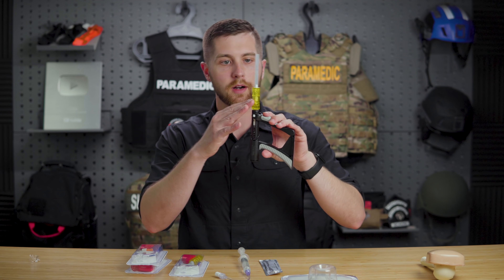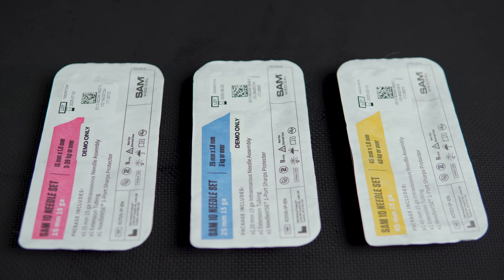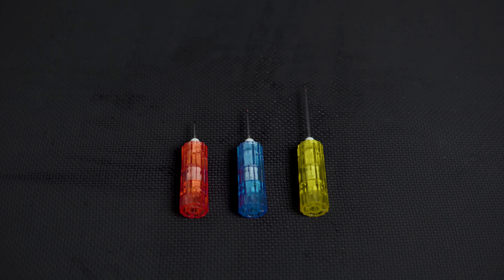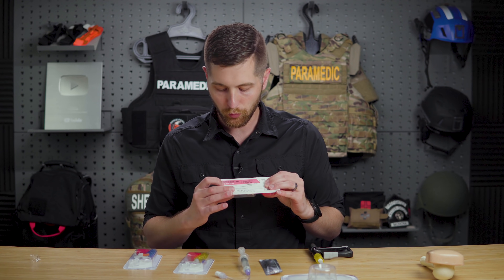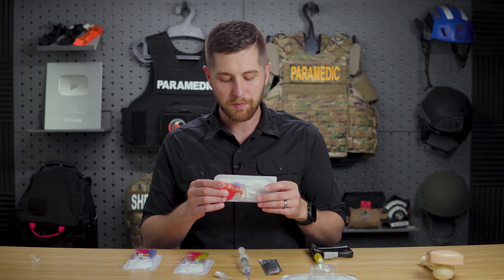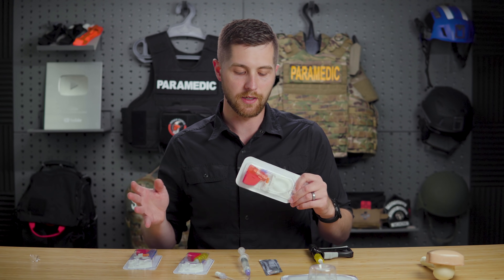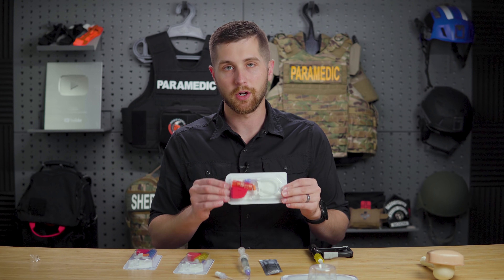The needles come in three main sizes: small, medium, and large — often thought of as peds, adult, and bariatric. The pink needle is 15 mm, 15 gauge, for patients between 3 and 39 kilograms. It's a very short needle used for patients without much adipose tissue over the site, generally smaller pediatrics. IOs are great for neonates and really small children because you can start them relatively easily.